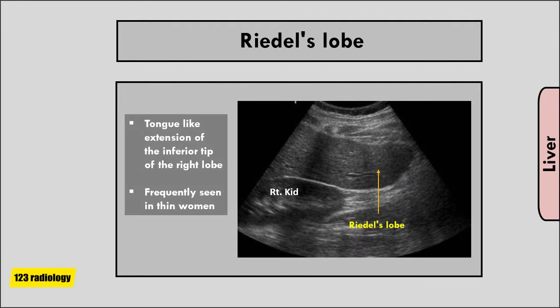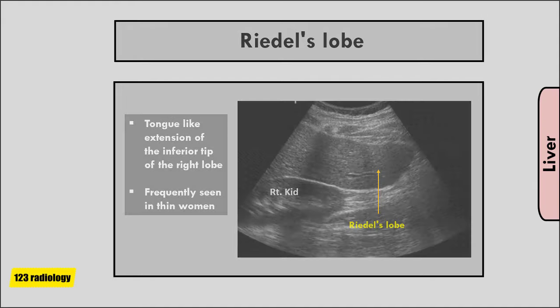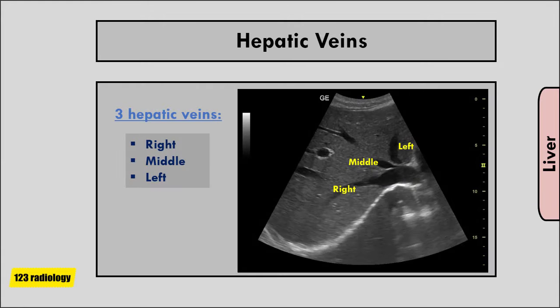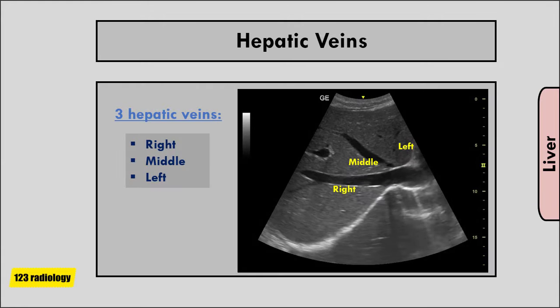Riedel's lobe is a tongue-like extension of the inferior tip of the right lobe of the liver, and this is frequently seen in thin women.